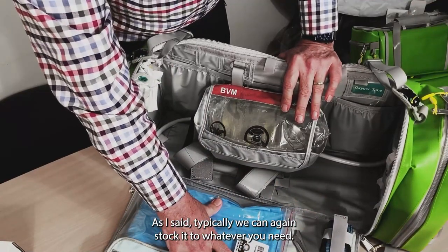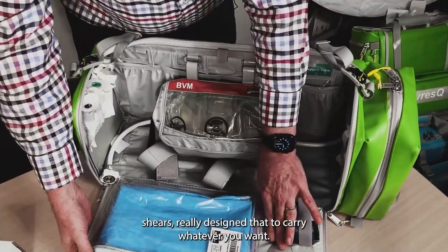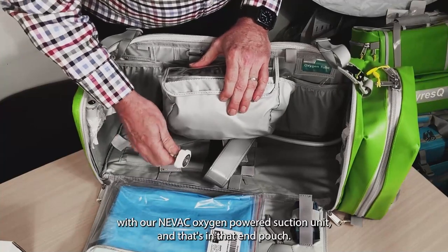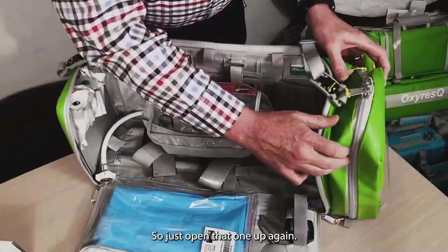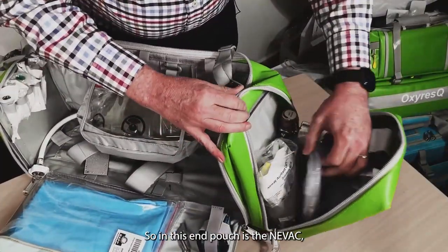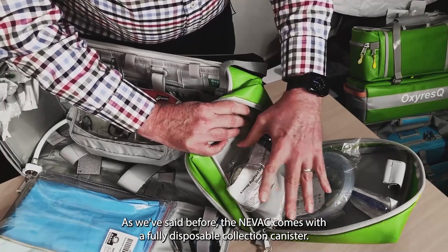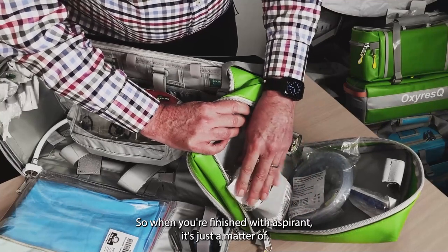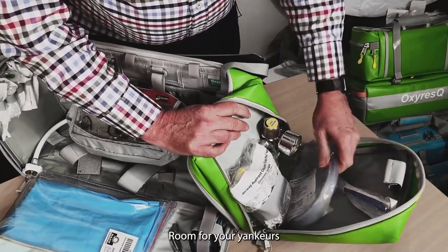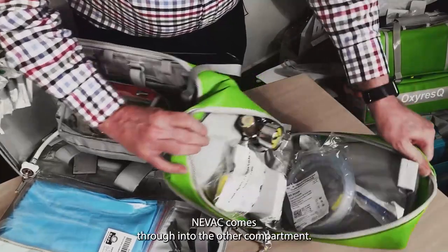We've also fitted it with our NEVAC oxygen-powered suction unit in that end pouch. The NEVAC comes with a fully disposable collection canister — when you're finished with aspiration, it's just a matter of sealing it up, throwing it away, and getting a new one. There's room for your Yankauer and suction hose, and the window for the oxygen hose for the NEVAC comes through into the other compartment.